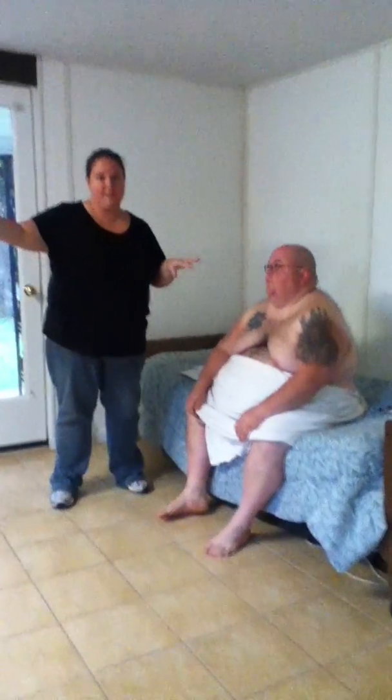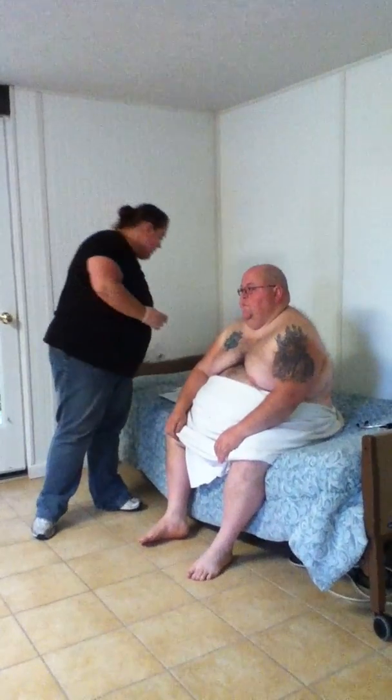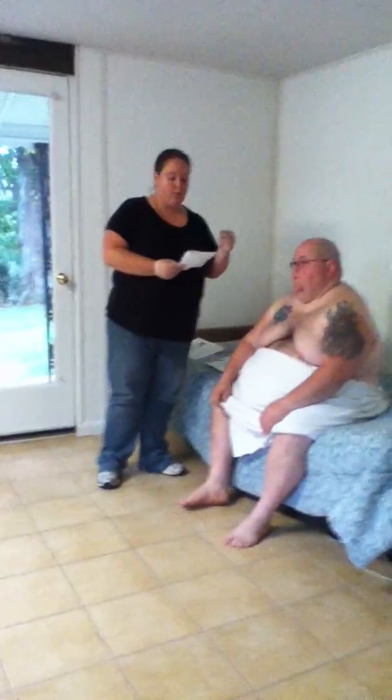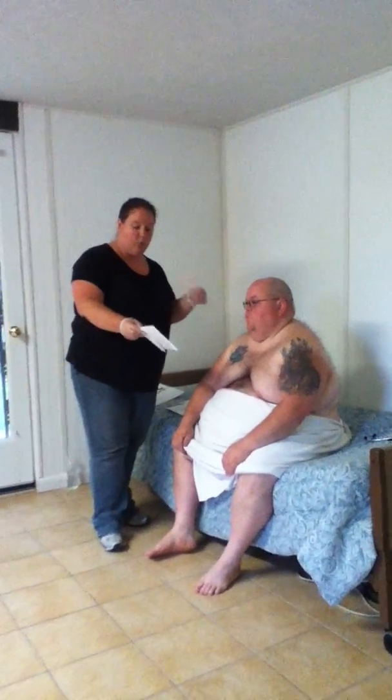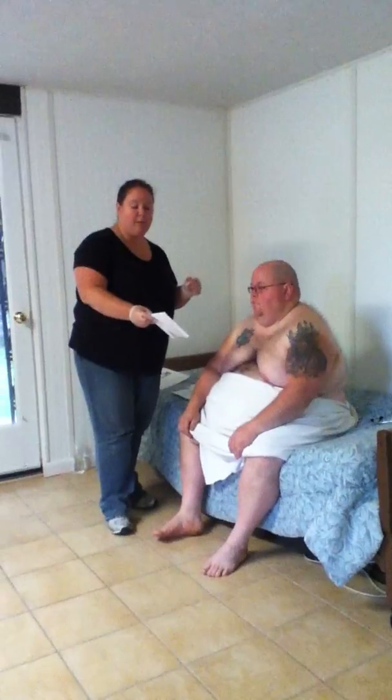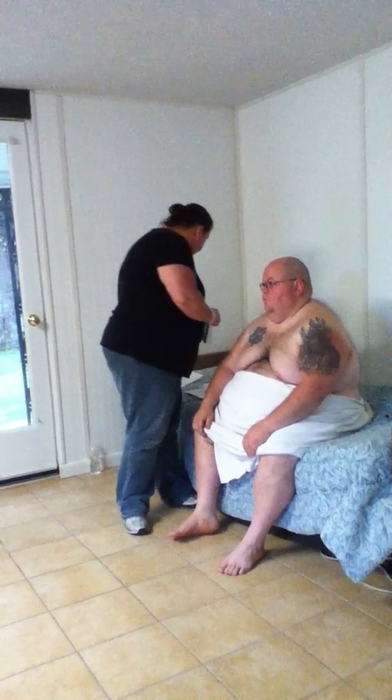glasses on, with their glasses off, and document that finding. You also take the Rosenbaum reading chart to check their vision acuity for reading. Place it approximately 14 inches away from their face to let them test their vision acuity for their near vision.